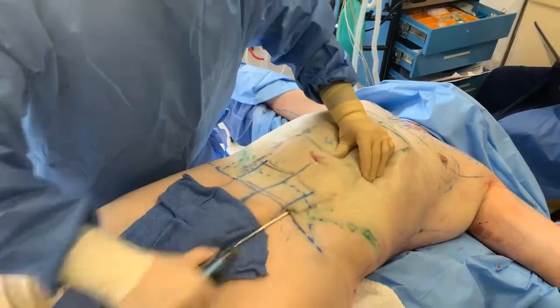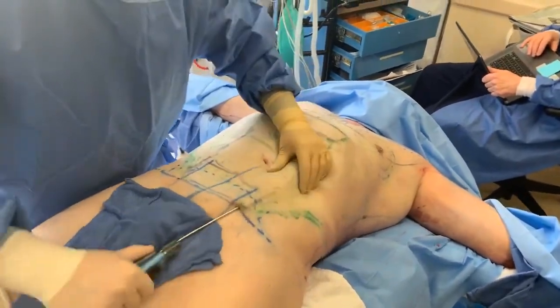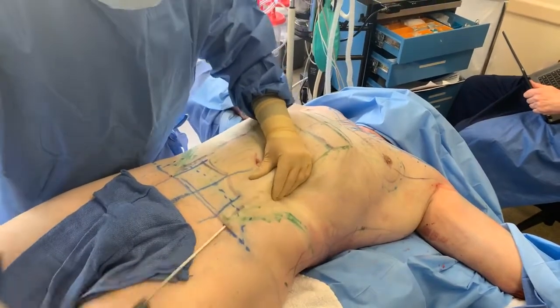So that's power-assisted lipo for sculpting, and we'll get back to you when we do the internal heating so you can see everything.